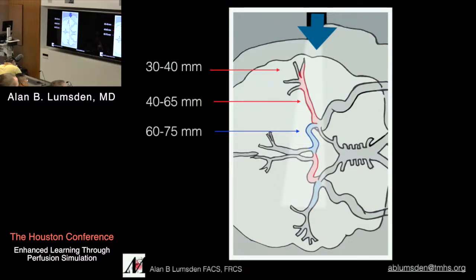Okay, TAVR. If you do diffusion-weighted MRI imaging of the brain after a TAVR has been put in, 70 to 100% of them are going to have things in their head. And what diffusion-weighted MRI shows is edema. Edema is because something has happened inside those blood vessels and damaged the blood vessels, okay? Most of those patients have no clinical sequelae that are identifiable. We have ignored this. It doesn't really matter. TCD, too sensitive. MR, too sensitive, just ignore this.